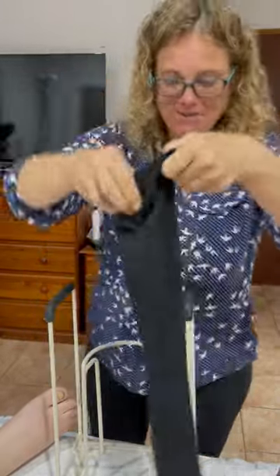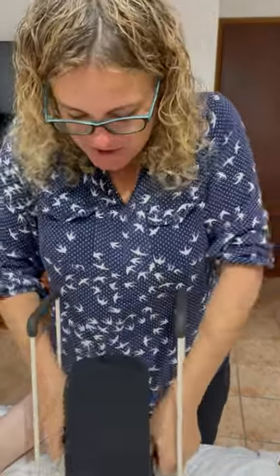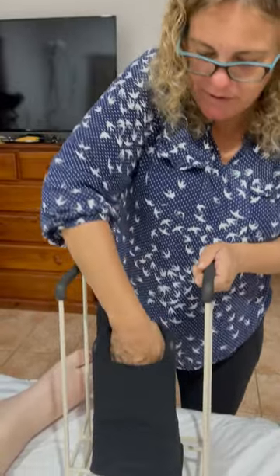We have the sock and the sock putter on — stretch it over. Probably best is to bring it all the way to the toes, then you can poke it in a little bit.